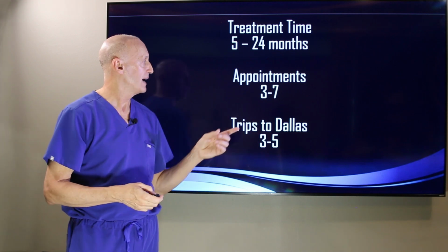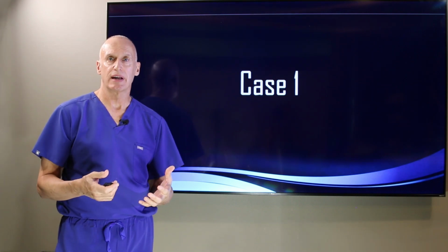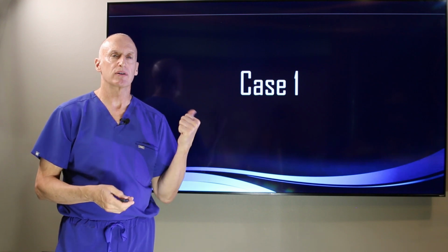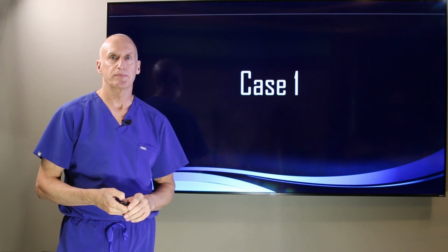So anyway, I mentioned that, and we'll go into case 1, which I'm going to do as a narrated PowerPoint presentation from this slide forward so that you can get a better image quality as we make progress. So stay tuned.